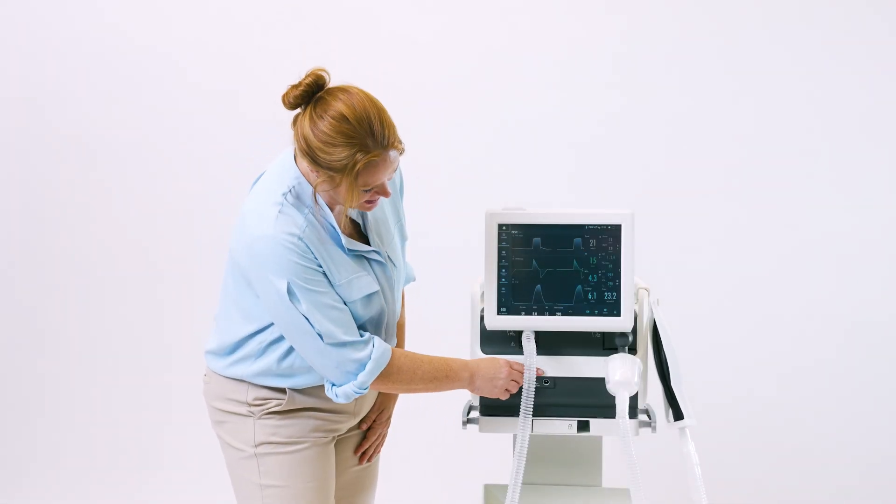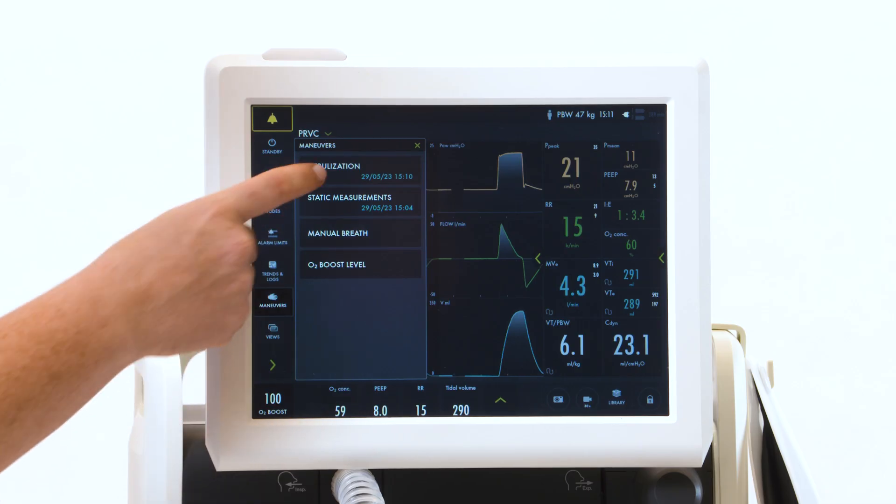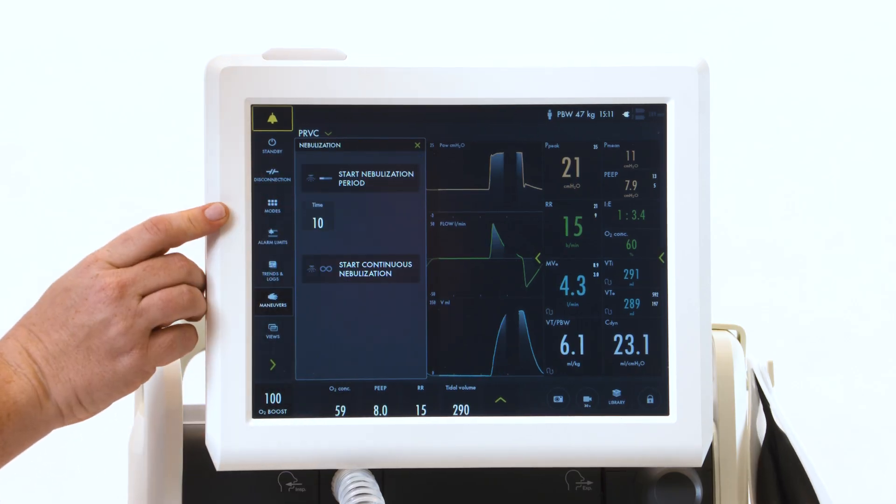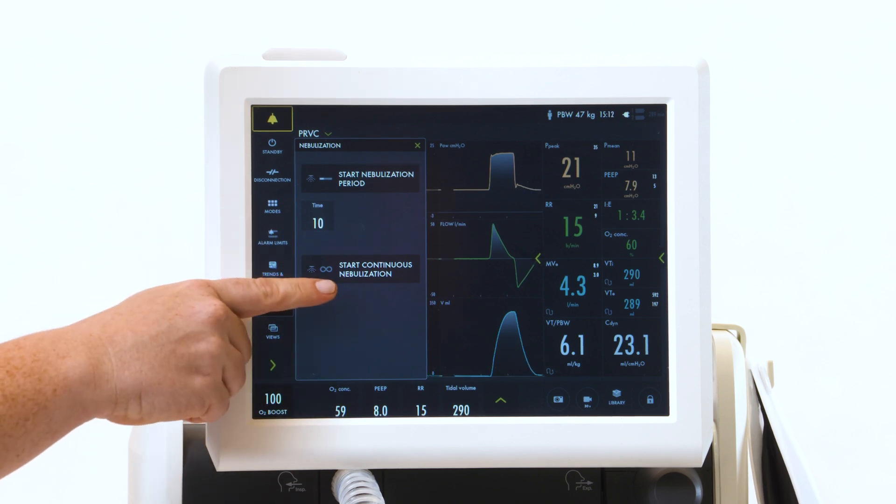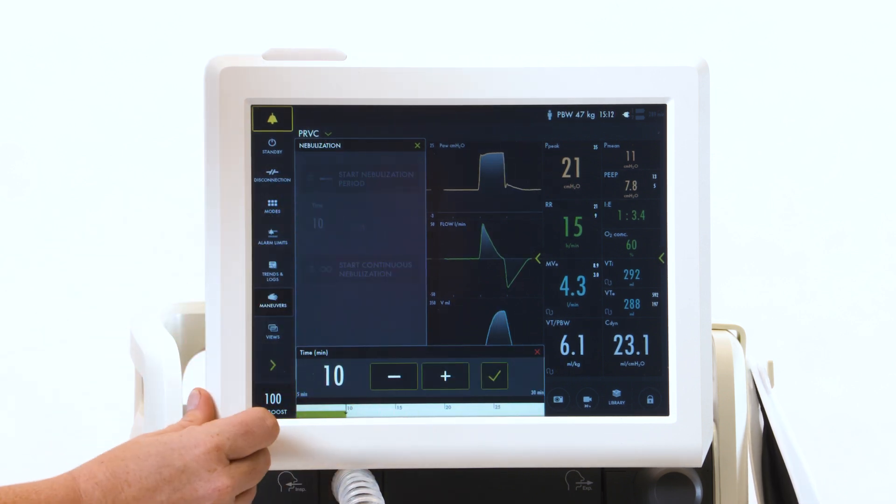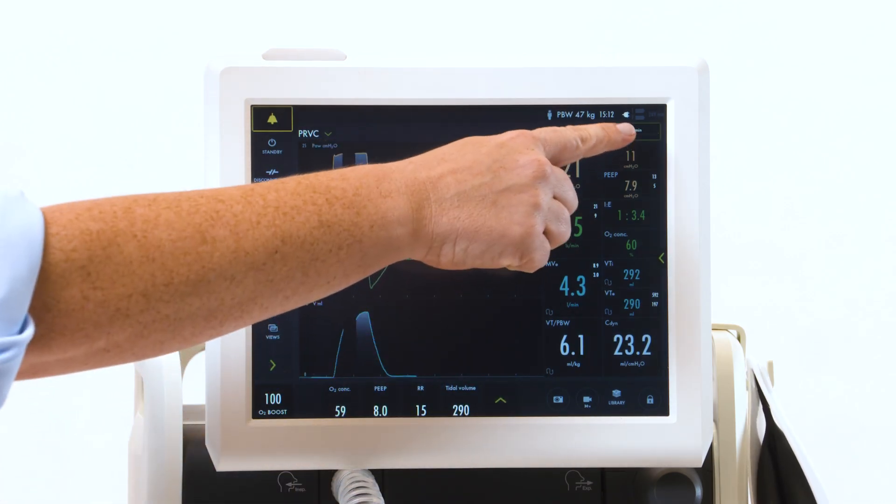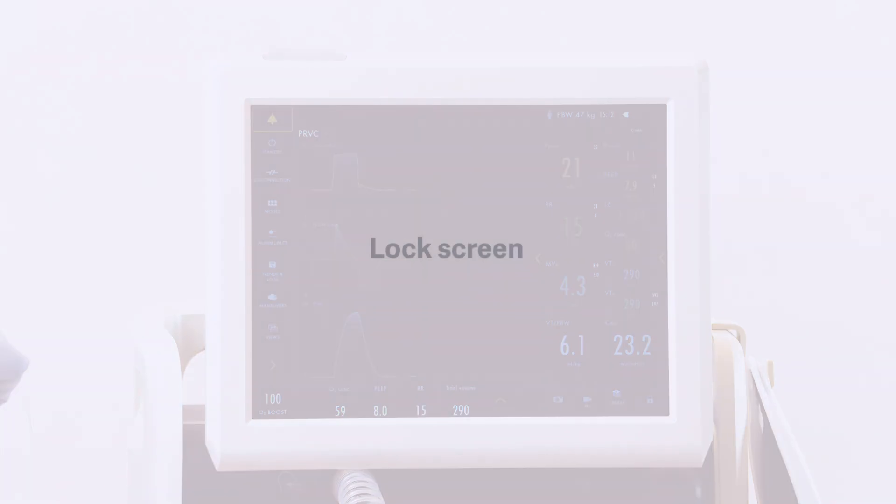AeroGen technology is built into every single ventilator and is connected at the bottom. Select the maneuvers tab and go to nebulization. You can run it continuously or intermittently choosing between 5 and 30 minutes. Check mark and hit accept and you'll see the nebulization appear.